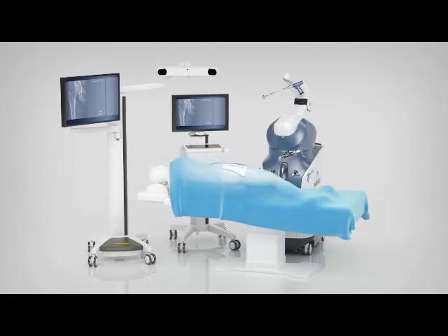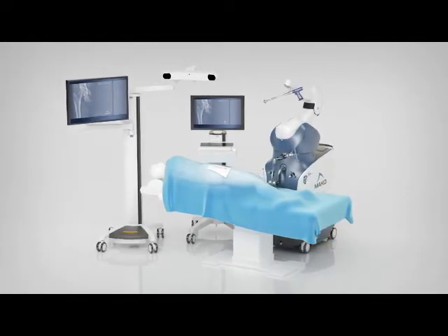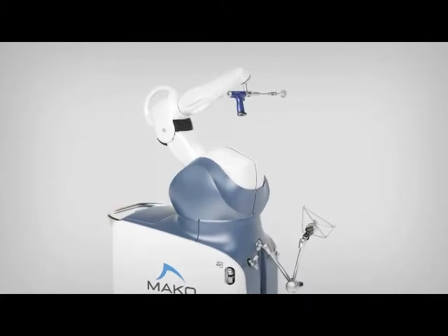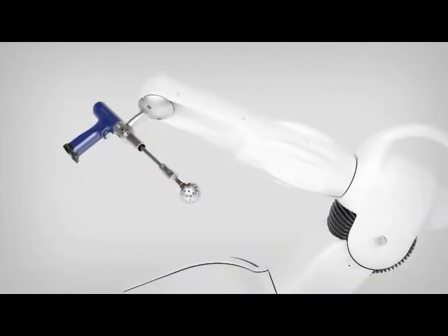Makoplasty Hip is a revolutionary surgical treatment option for adults needing total hip arthroplasty. The Rio Robotic Arm Interactive Orthopedic System assists surgeons in achieving a new level of precision and more ideal hip implant positioning.